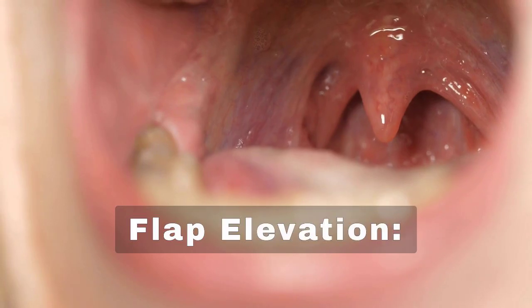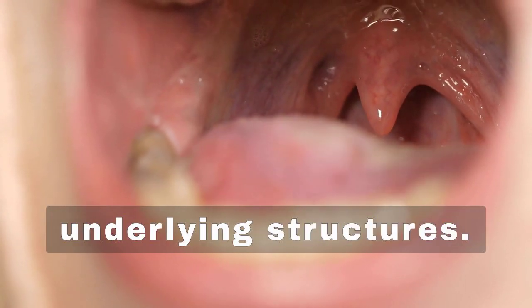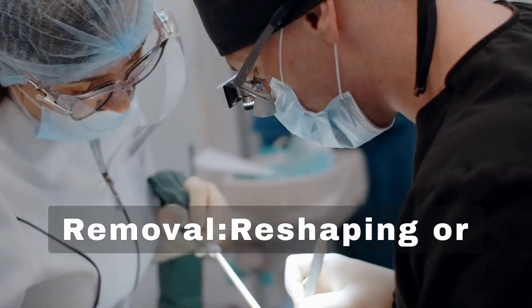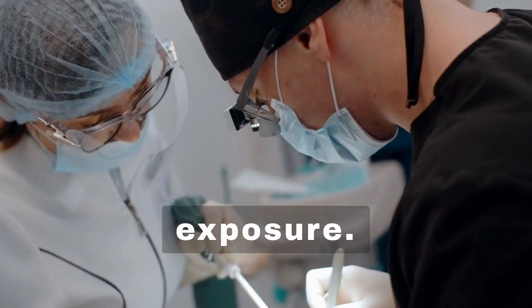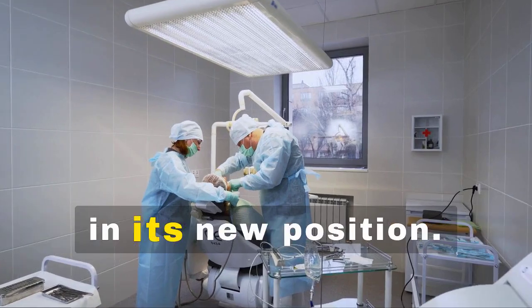Flap elevation, lifting the gum tissue to access underlying structures. Bone removal, reshaping or removing bone to achieve the desired tooth exposure. Suturing, securing the gum tissue in its new position.